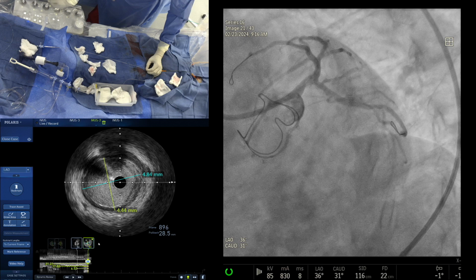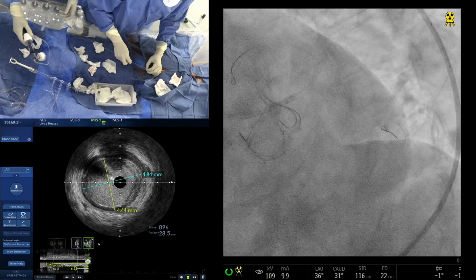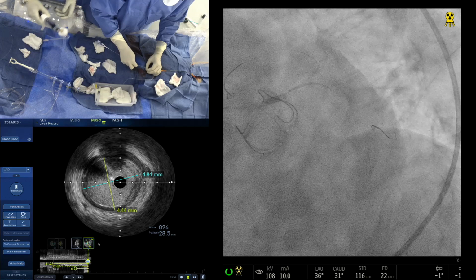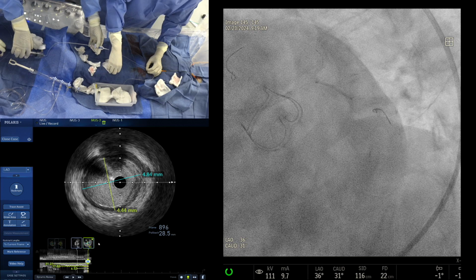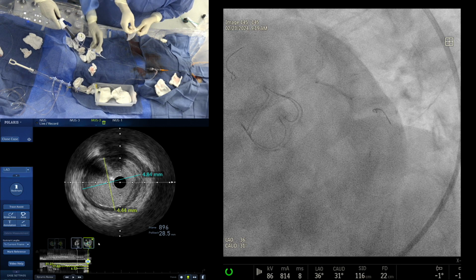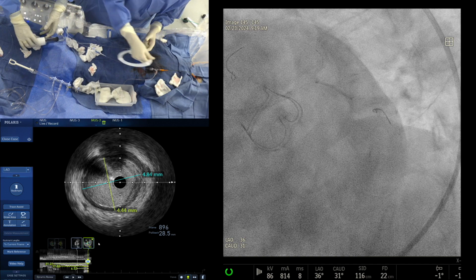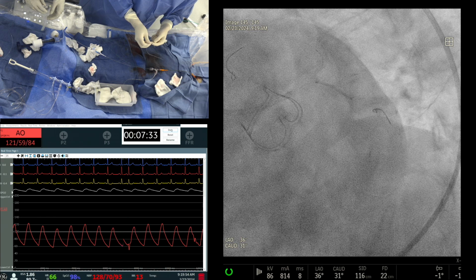Thick strut. Yep. Good. So now we are putting the stent in the circumflex first, and let's get the 4.0 by 20 Megatron. Yeah. So we are in the circumflex. Good. This is the key. So 7 French will take 2 stents. Can you show the side by side mini crush? So we'll show the bifurcation. Take the IVUS out. Right now we can take the IVUS out and just use the bifurcation 3D app with a mini crush.